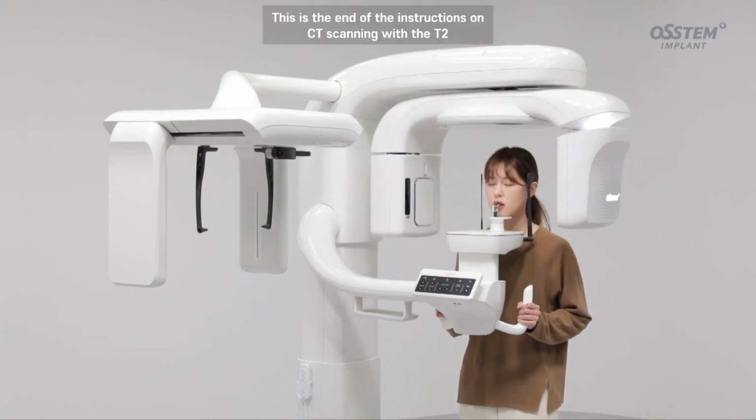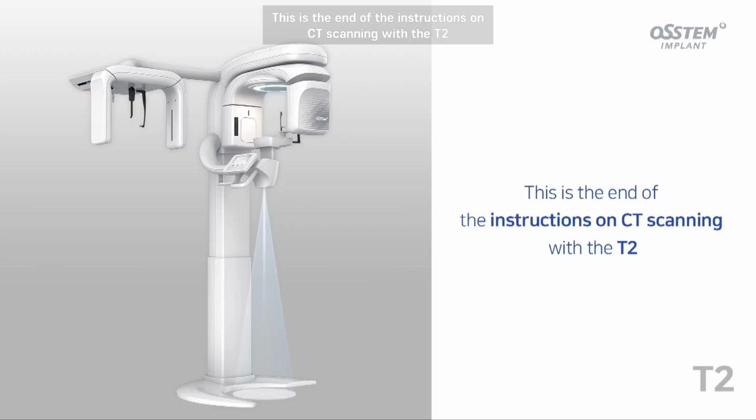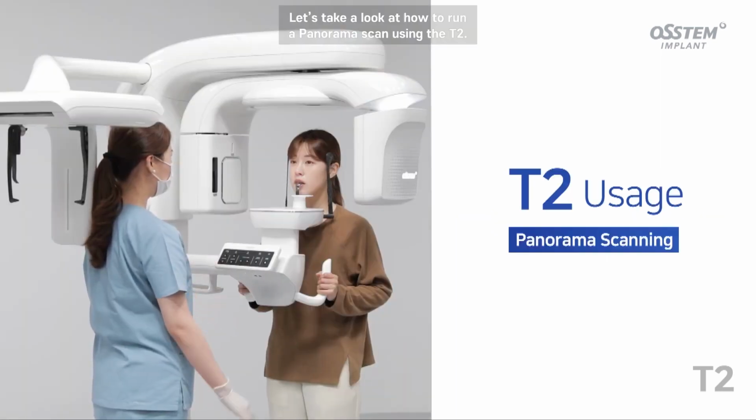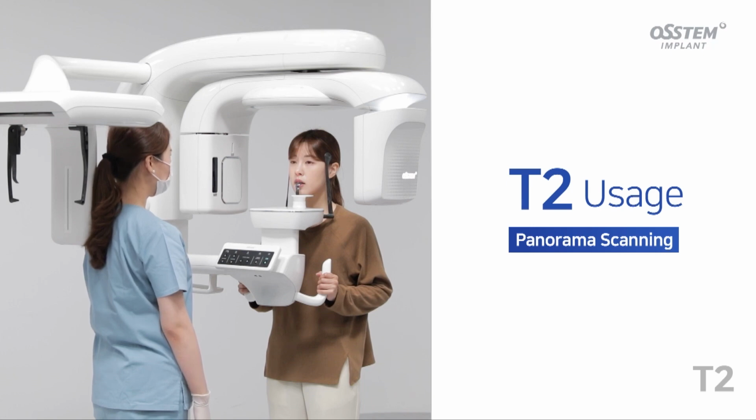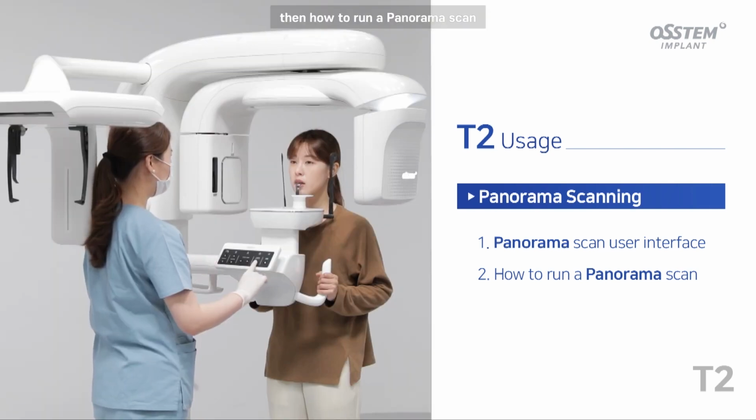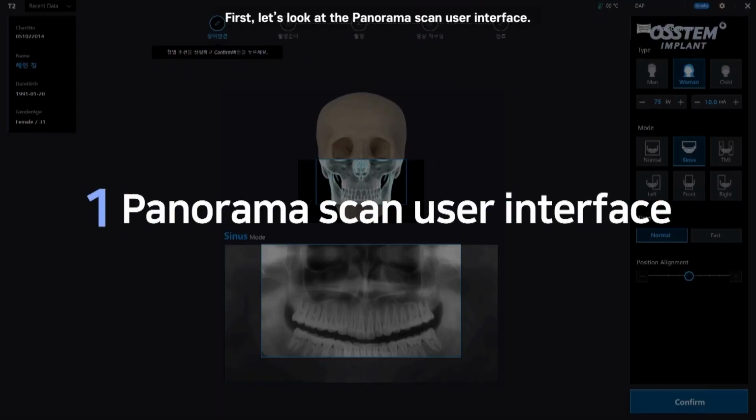This is the end of the instructions on CT scanning with the T2. Let's take a look at how to run a panorama scan using the T2. First, we'll be looking at the panorama scan user interface, then how to run a panorama scan. First, let's look at the panorama scan user interface.